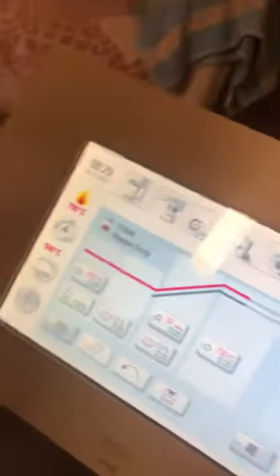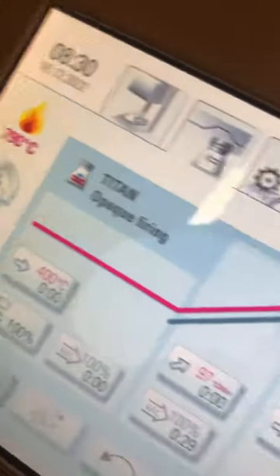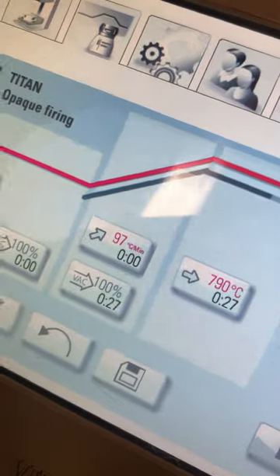This machine is operating. Pressure is 760. Vacuum 100%. And it is rising phase.